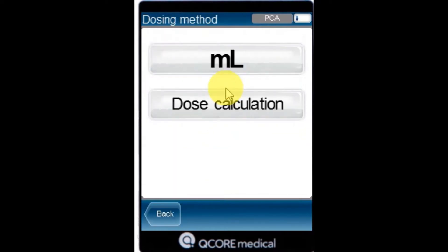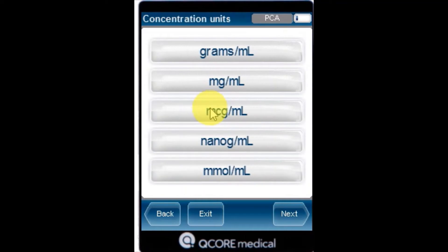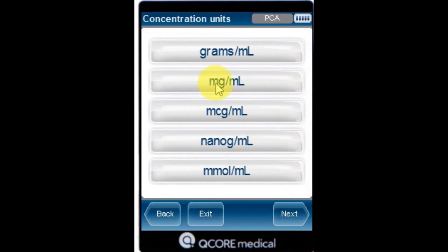The dosing method screen appears. Select Dose Calculation. From the concentration unit screen, select the appropriate drug units.